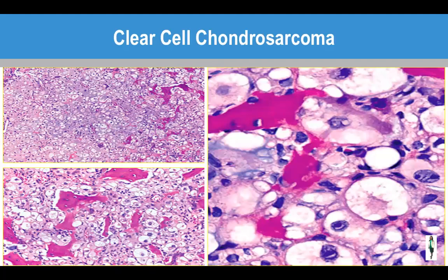So the 4th type of chondrosarcoma is clear cell chondrosarcoma. Under low power, you can recognize the chondroid appearance because the cells have this rigid border and centrally located nuclei. They're malignant because the nuclear features are malignant. But those cells are very impressive with this abundant clear cytoplasm.